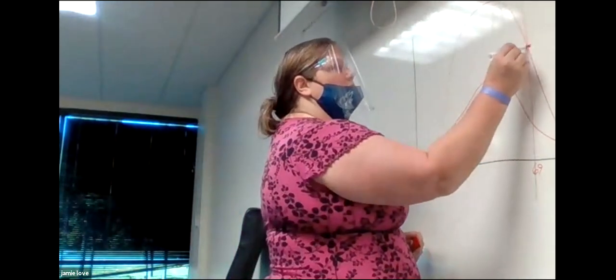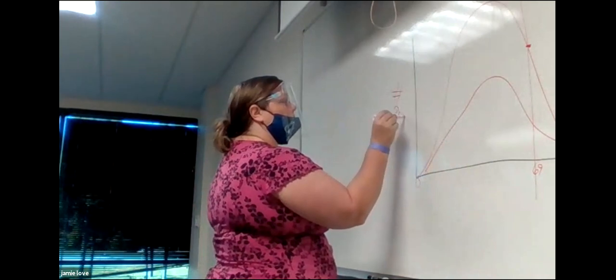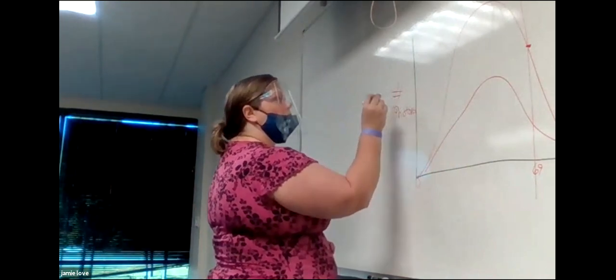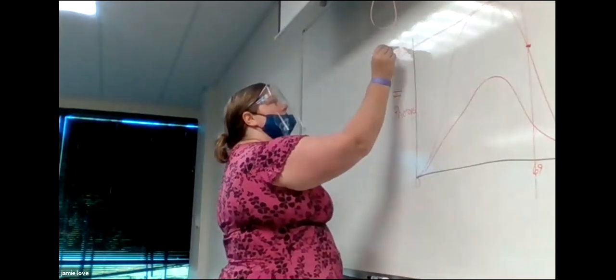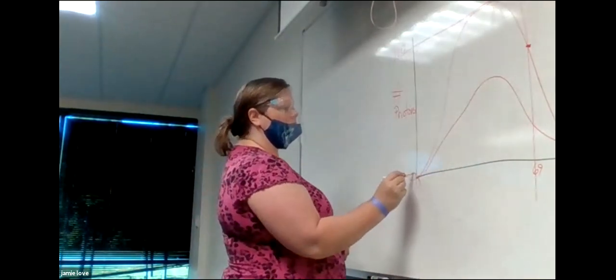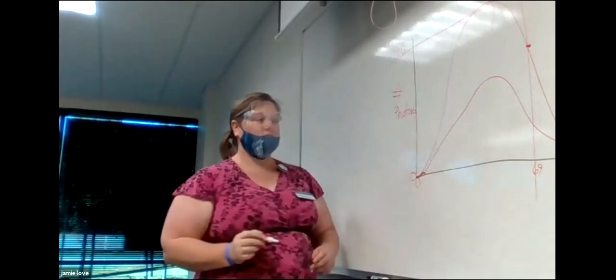So whatever level, what's the other side of that? Number of X-rays, 0, and it doesn't really give us any numbers. But these are number of photons. So we'll just say at this peak is 100, just because that's where this one ends. And down here is 0 photons. So at this level here, we don't have any photons at 0.